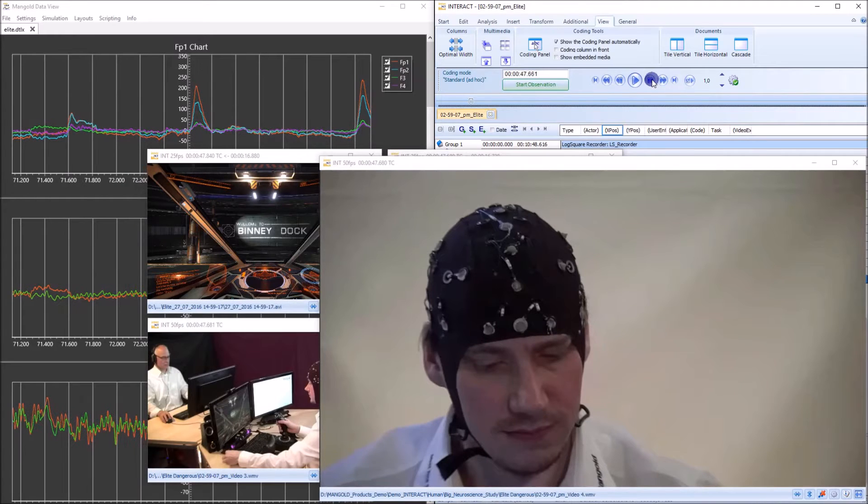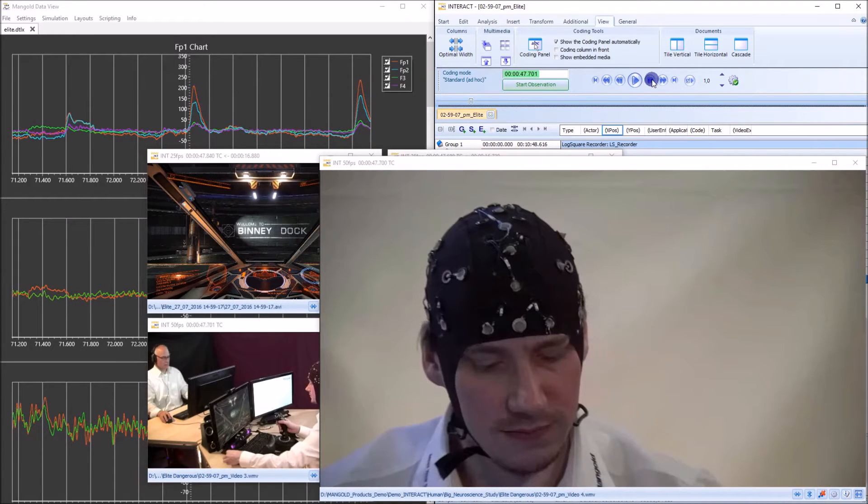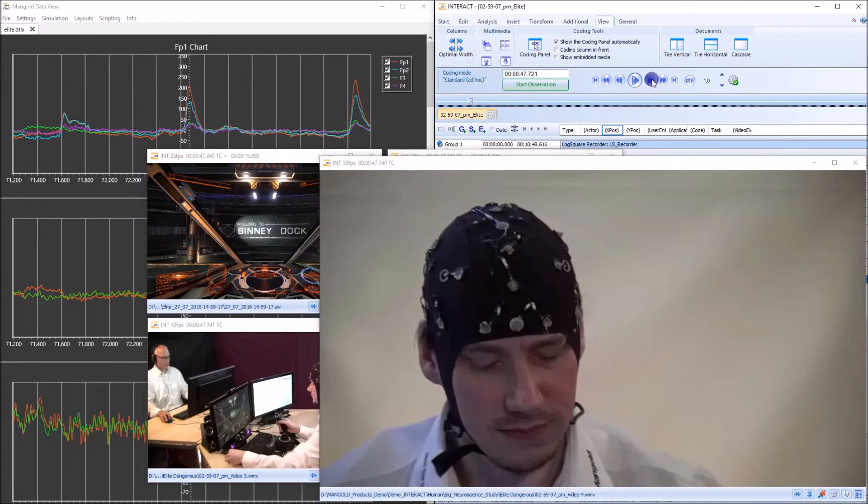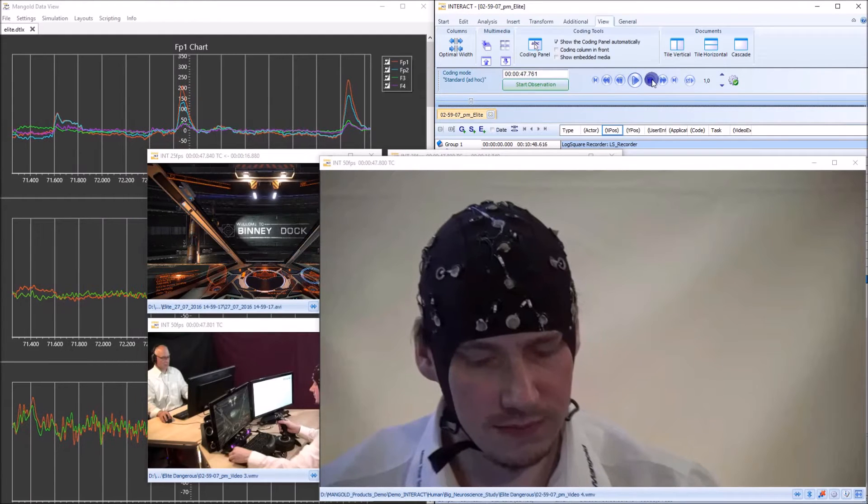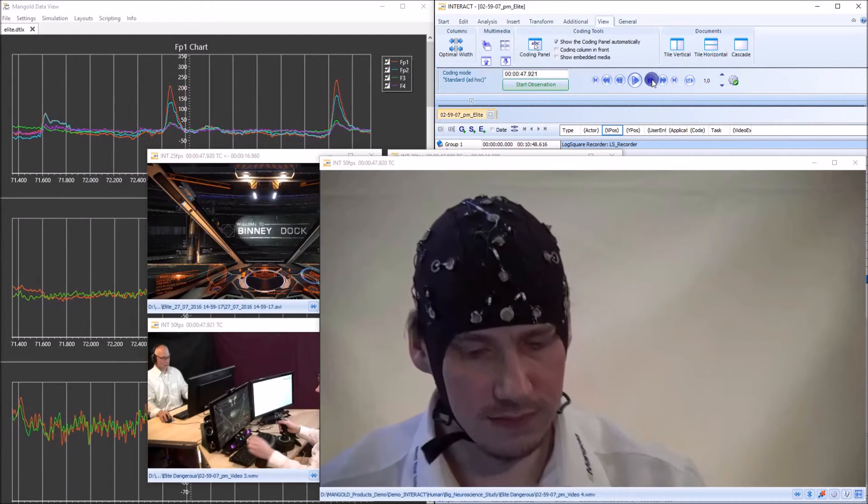Now the participant is closing his eyes here. That's exactly what you see in the FP1 and FP2 chart. Let me go a little further.